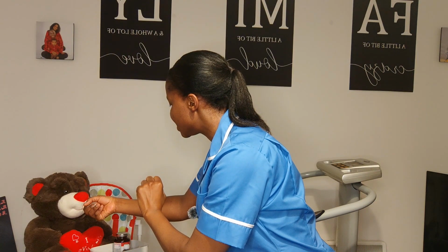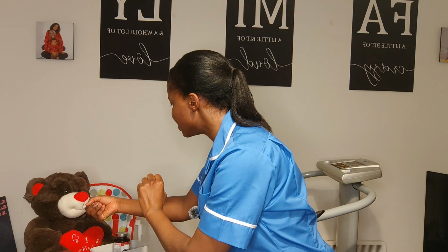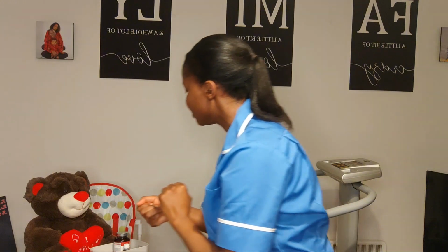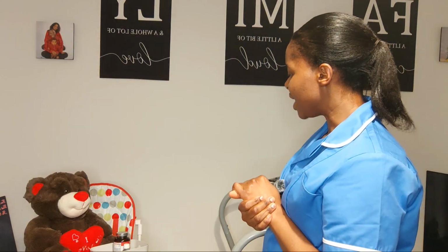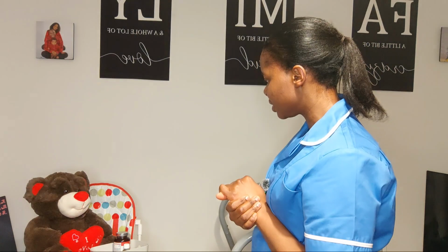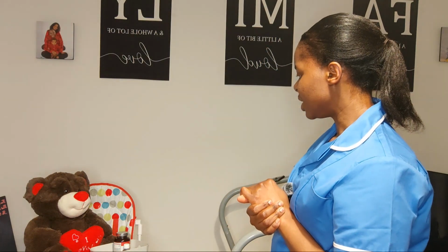Hold your breath for 10 seconds. 1, 2, 3, 4, 5, 6, 7, 8, 9, 10. As I remove the spacer from your mouth, could you please exhale through pursed lips? Correct. How do you feel? Are you comfortable? All right.